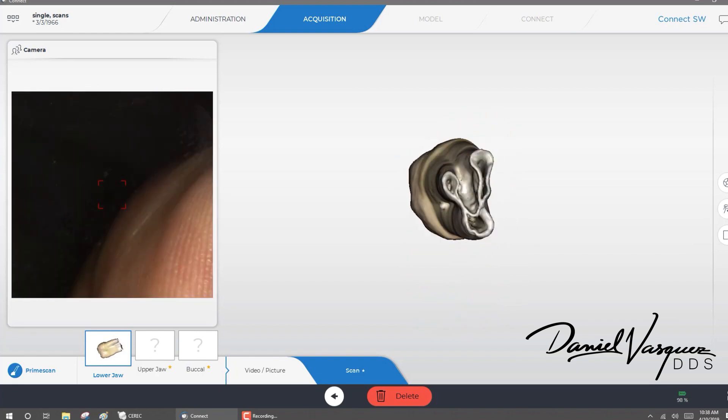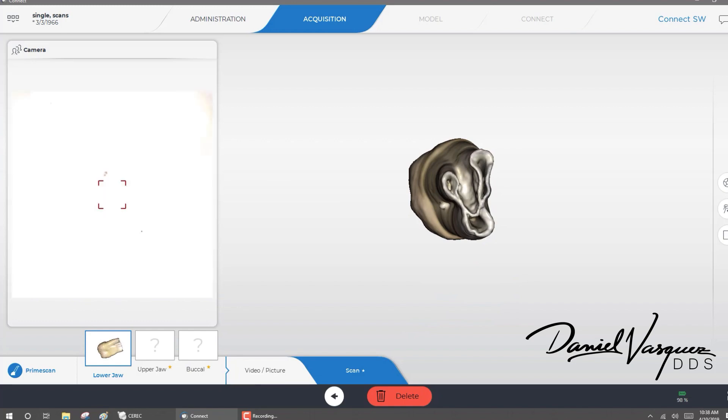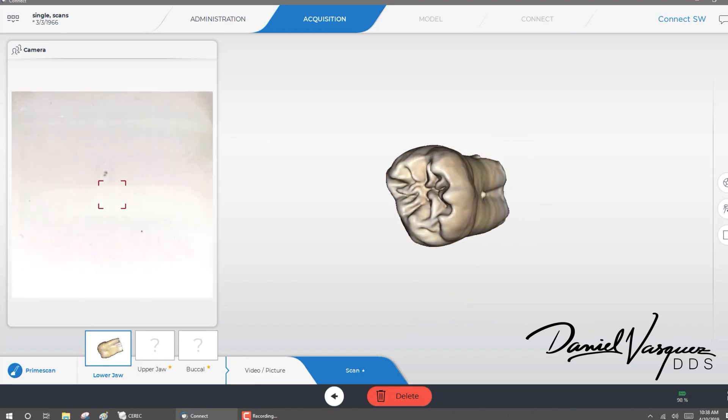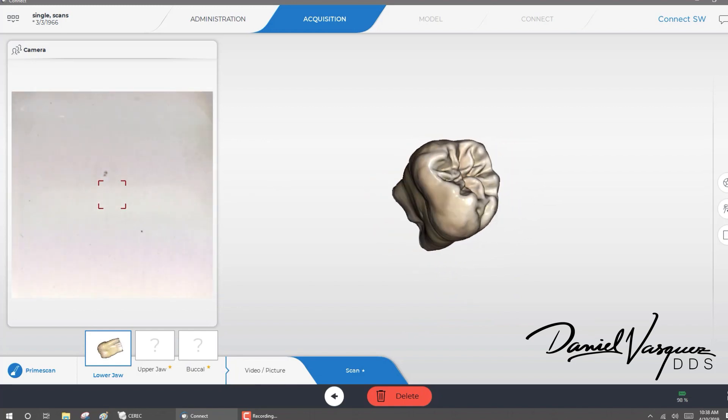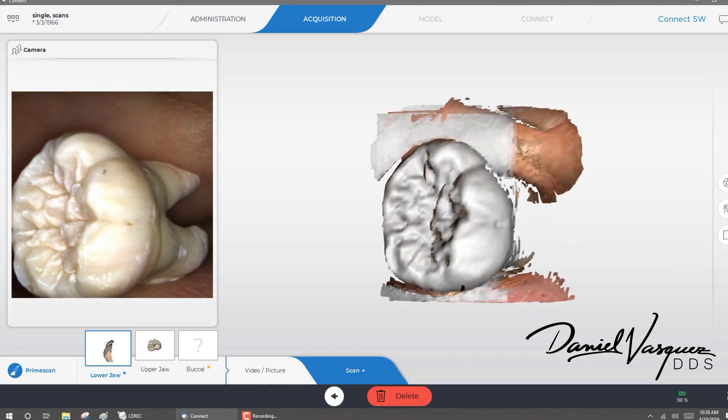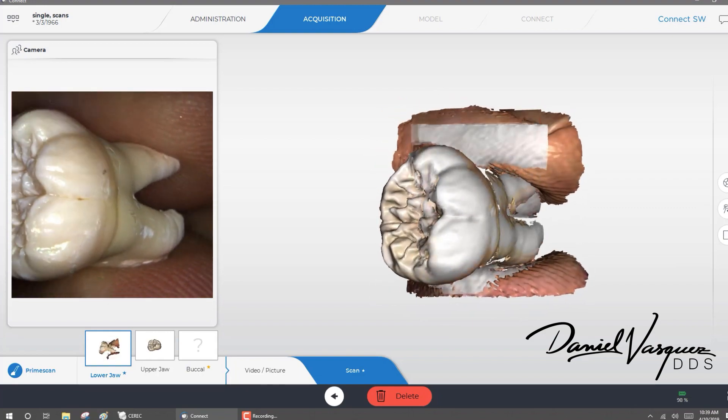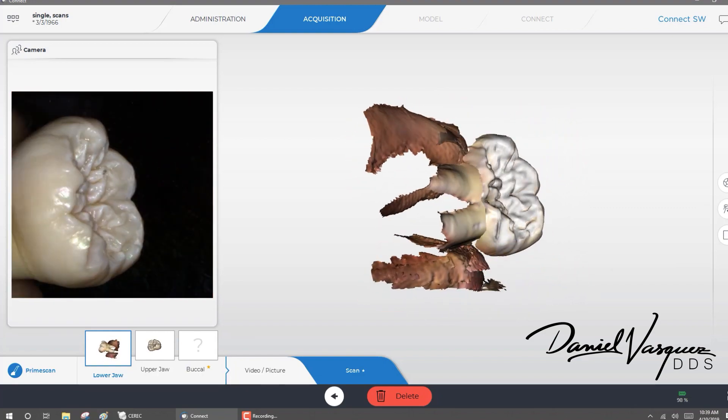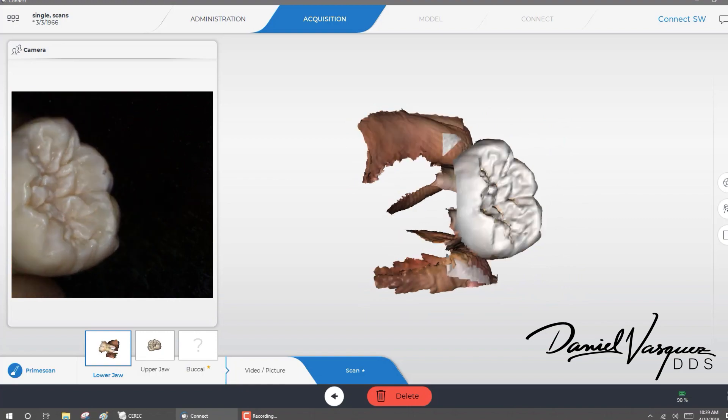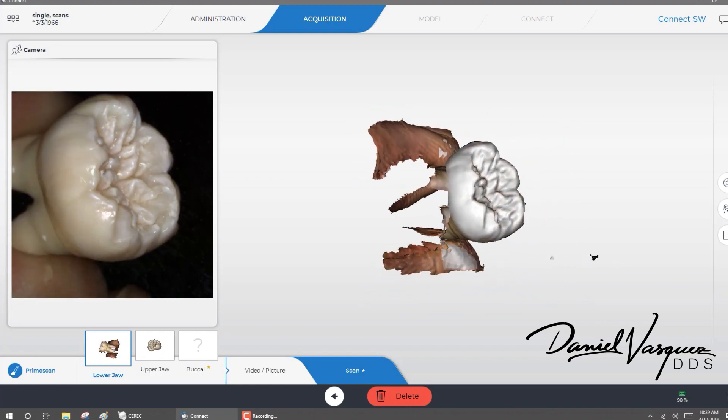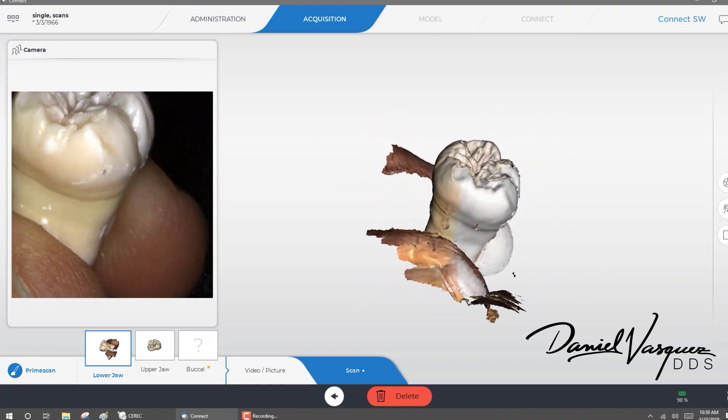One of the benefits that I've been seeing with Prime Scan is the speed. It's just extremely fast. It's easy to use. The accuracy and precision that it has, not only on the scanning but with the restorations that I've been delivering, it's just crazy. Look at this.